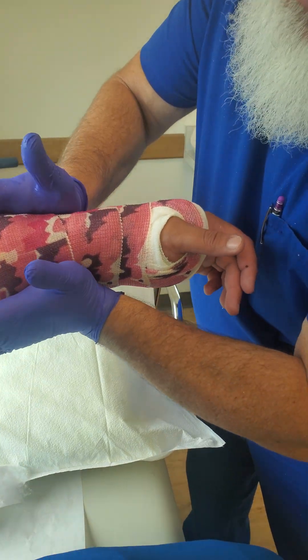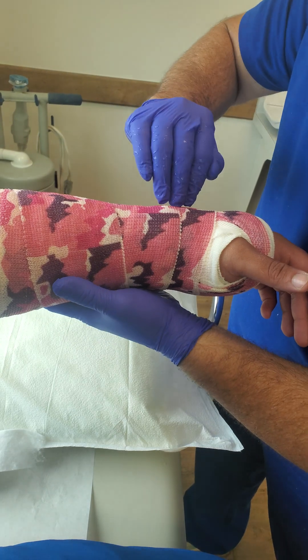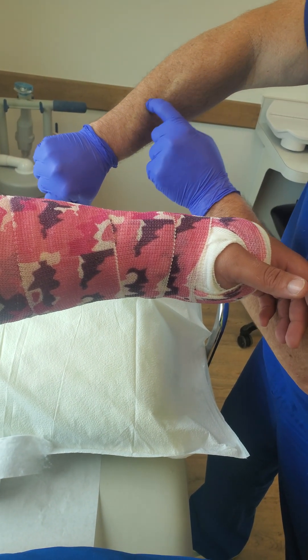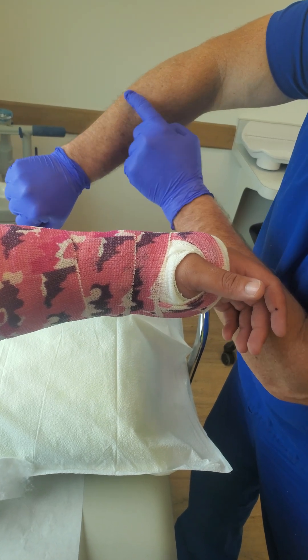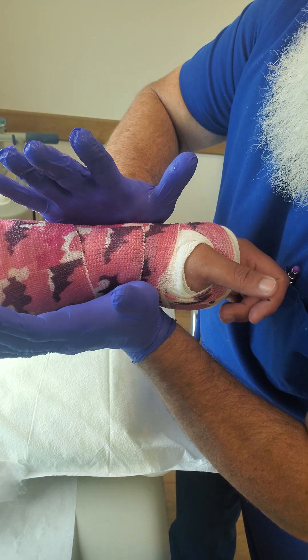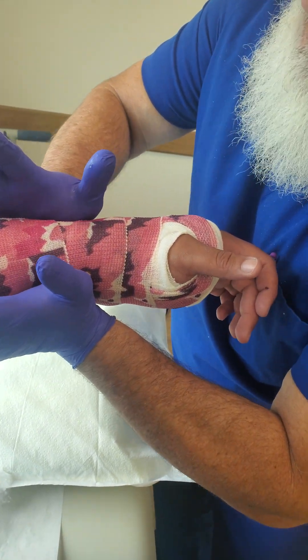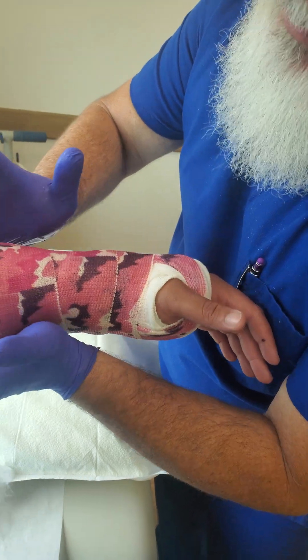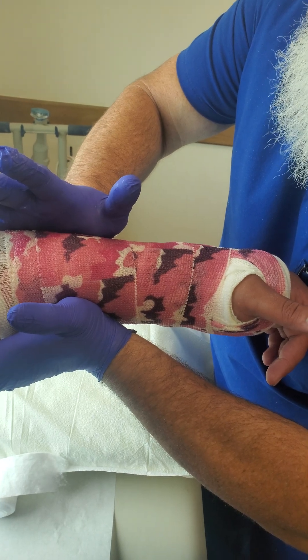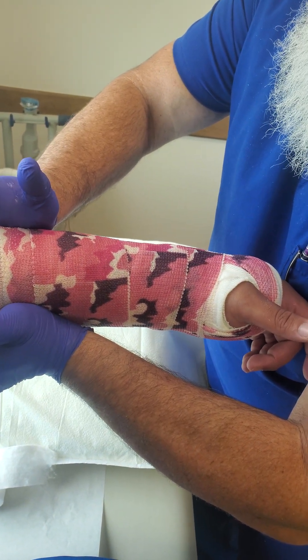— even the meaty part of your hands — and you're basically flattening the space. It's called the interosseous mold because you're going into the space that lies between the radius and the ulna. You have that empty space right in there between the two bones — that gap that goes right down the middle. So you're using the palms of your hands to flatten out that interosseous space. I'll be straight with you — I am putting a little bit of force on here.